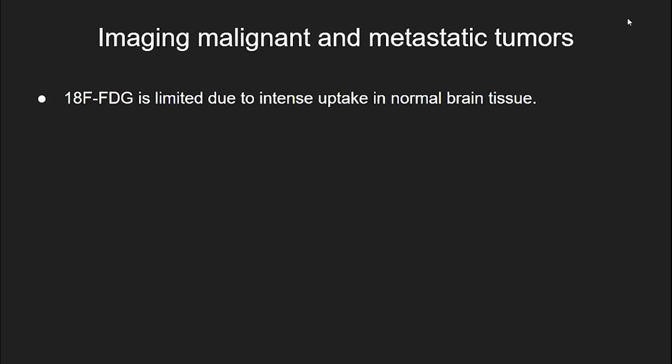So now let's turn our attention to malignant tumors, including the most prevalent brain tumor, tumors that metastasize to the brain. There's going to be some key points that I want to summarize here. First, 18F-FDG is limited in imaging brain tumors due to intense uptake in normal brain tissue.